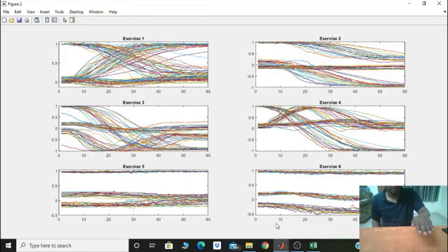We are looking at 6 different exercises. Exercise 1 begins by keeping your hand horizontally. You can see like this, and your palm should move up from there gradually so that it is completely vertical at the end of the exercise. The second exercise is starting from horizontal, and then the palm moves down, finally coming to rest in a position like this.